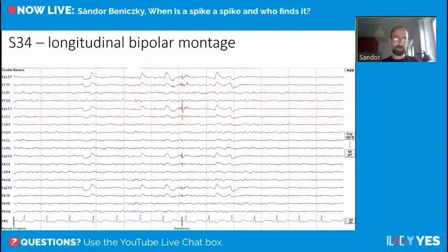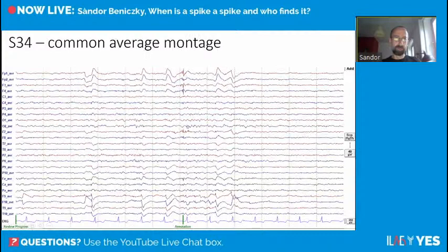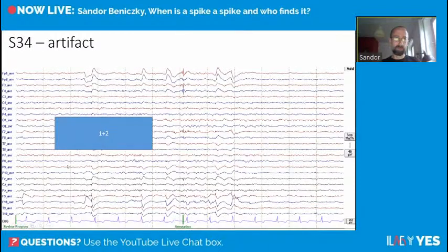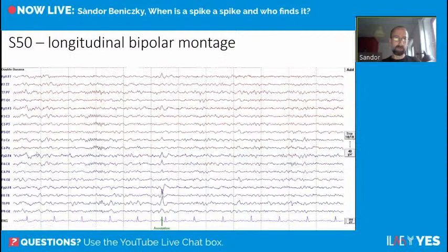Next example: in bipolar montage there is a phase reversal, and in common average montage the voltage map is irregular and doesn't make sense as a brain source. This transient only fulfills two criteria — it's spiky and the wave duration is perhaps different from background. This does not fulfill our criteria for an interictal epileptiform discharge.